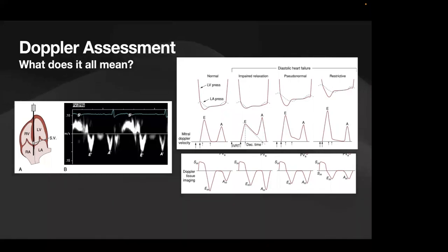Then the next one is, as your diastolic failure increases in its grade, you'll see there are changes to your left ventricular pressure waveforms. And similarly, like we saw, we're going to drive changes in your E's and your A's. So you have your E and your A at the very left, which is showing you the normal pattern, and the large arrows that are right at the bottom of that line are telling you what your isovolumic relaxation time is, because that's the amount of time that you're going to sample your dPdt to get tau.